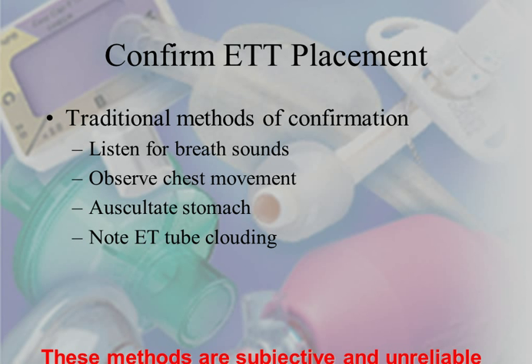Essentially, like for breath sounds, yeah, I think I hear them, I'm not sure. Chest movement, that may be a big chest movement before, it may not be. If I don't know the patient that well, I'm never going to know that. Auscultating their stomach is not a good reliable source. Sometimes you can't hear anything in their stomach. Sometimes you'll listen to the breath sounds and actually hear them in the stomach, and vice versa. Or you listen to the stomach and you hear breath sounds. And then noting the endotracheal tube clouding is just not a reliable source as well.